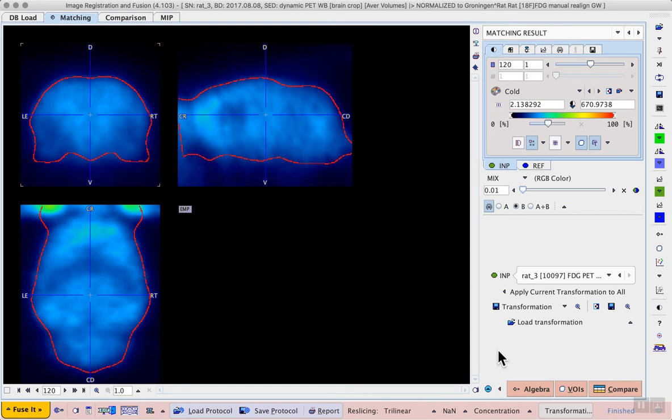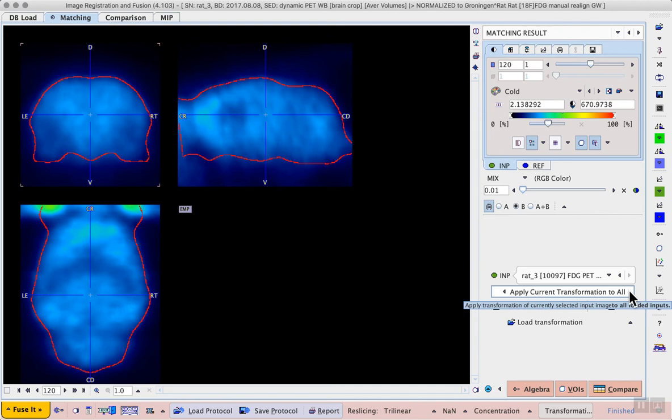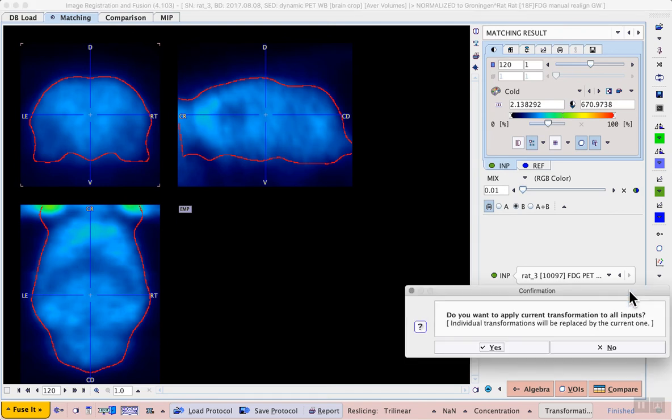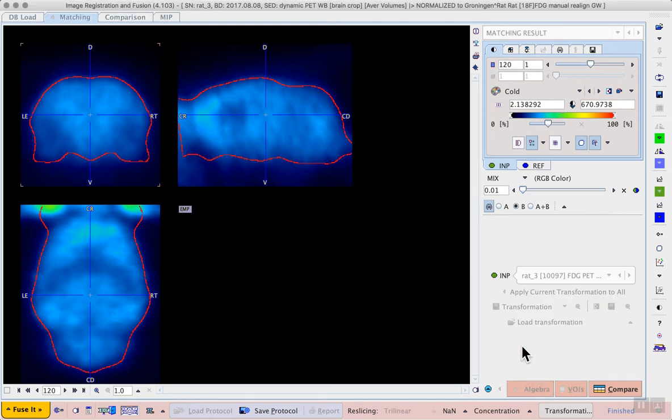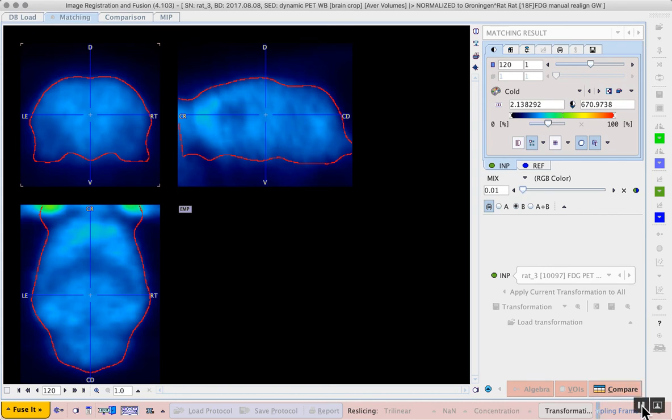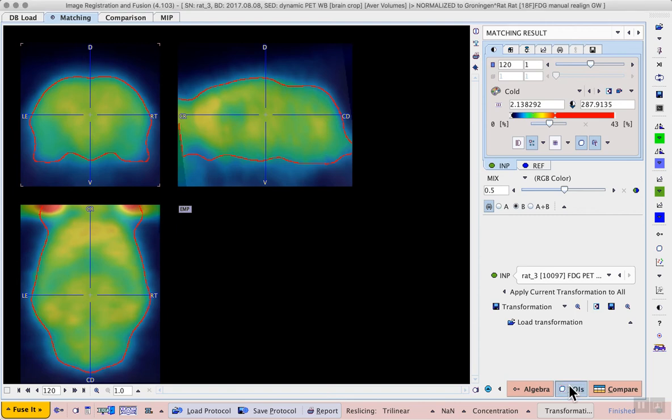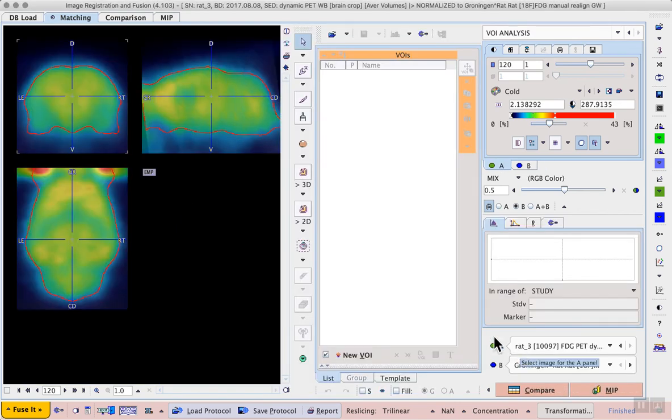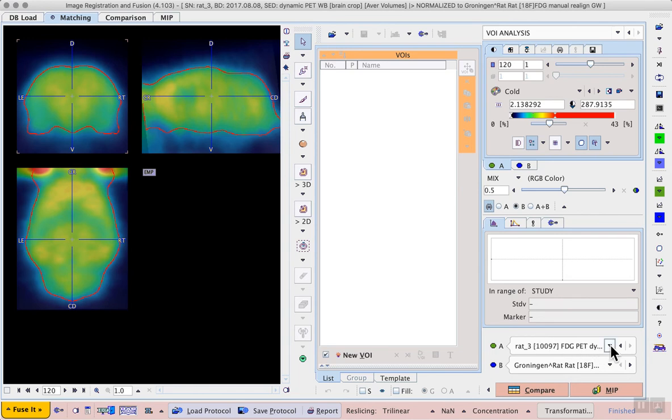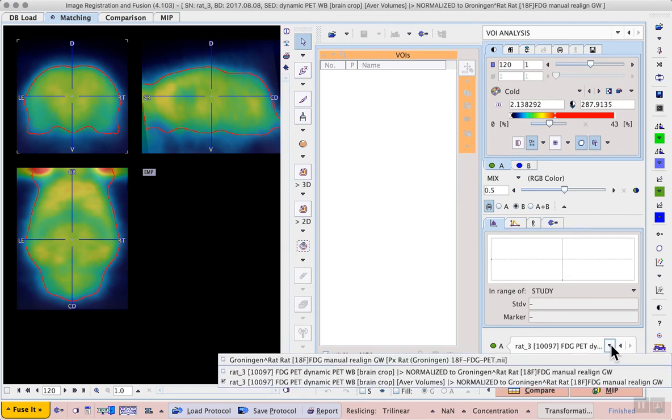The transformation can then be applied to the original dynamic data using the button Apply current transformation to all. This will take some time since there are 23 frames. Once the application of the transformation is complete, we can proceed to the VOIs page.